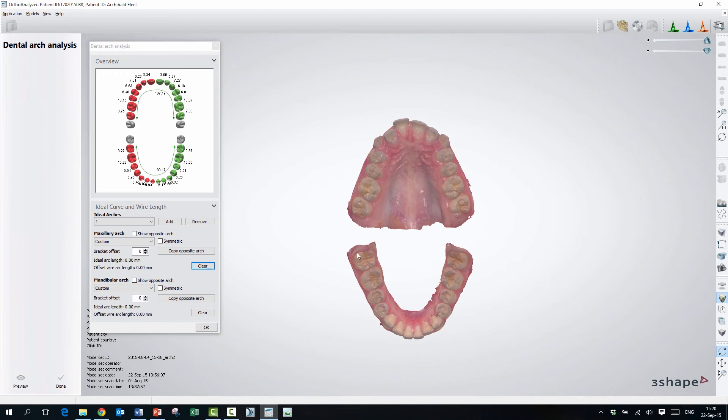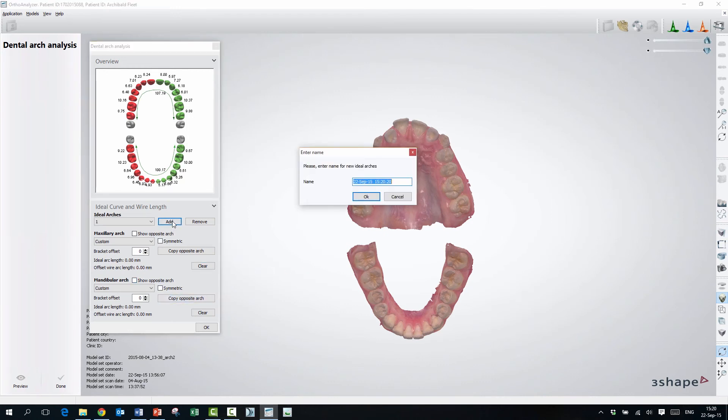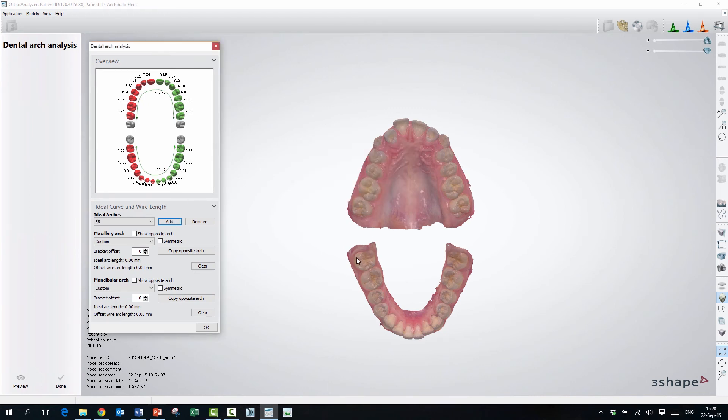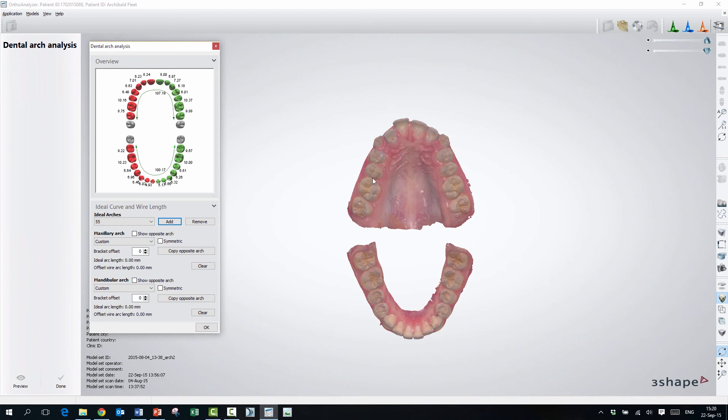Now I will show you—we will create an arch here and then use it in our virtual setup. One good tip is that if I create a new arch, I will just press Add again and press OK. And now I know that these cuspids of my teeth should actually, when the patient bites together, go in here to the antagonist there. Exactly.